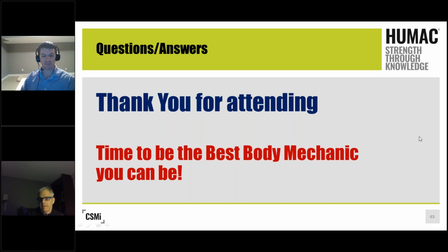Okay. And that's a great question. We're going to really get into speeds of exercise a little bit when we get into isokinetics, because I want to get heavy into the science behind it. When we talk speed, this is where it's so difficult, because everybody's used to thinking degrees per second. But what we have to start to think about is speed over range of motion. We have to talk about the distance that we're moving and whether or not that activates as a slow, a medium speed, or a fast speed.